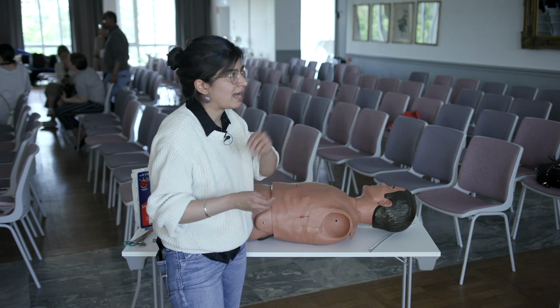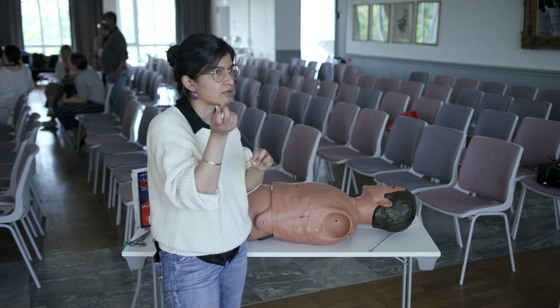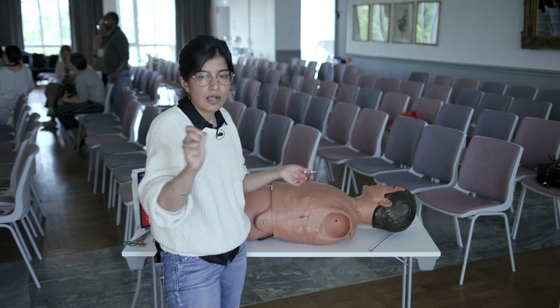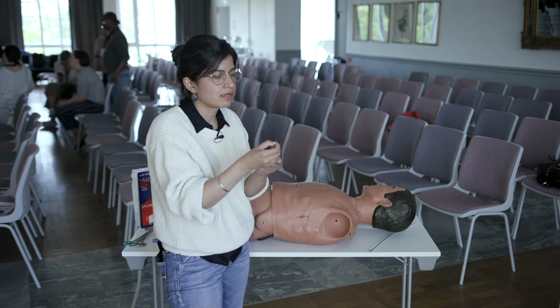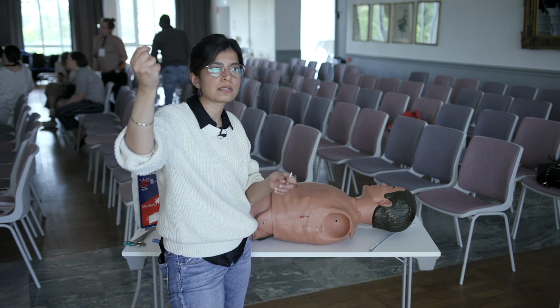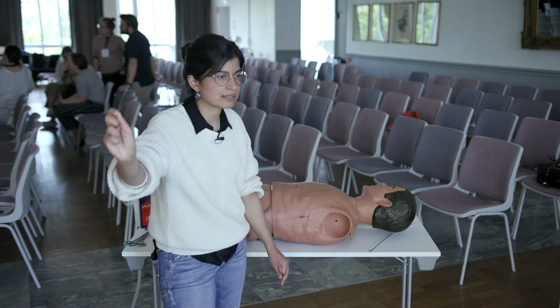The other thing is if you have a kit that doesn't have this handy dandy piece, these are all elastic coil wires. Every J-loop will be the standard. This should be a 19 millimeter. Because they're elastic coil, if you push them, it straightens the loop. It's a little bent, so it's not perfect. But if you pinch and push, do you see how it straightens the tip? In a perfect world where the wire is not already bent, it will fully straighten the wire. If you pinch and push. Okay? So if you want to practice, go for it.